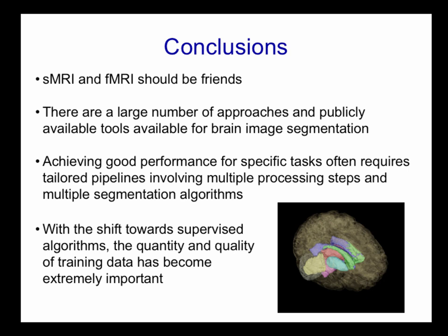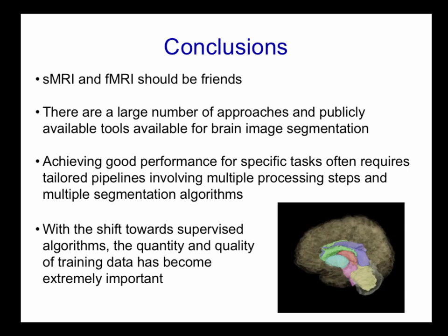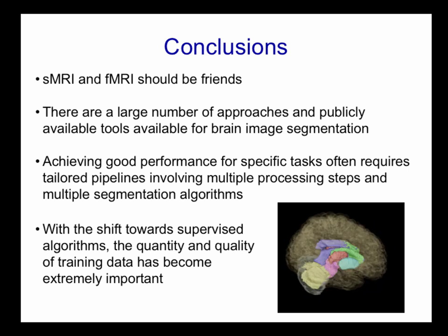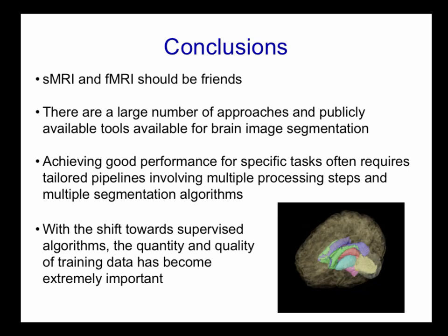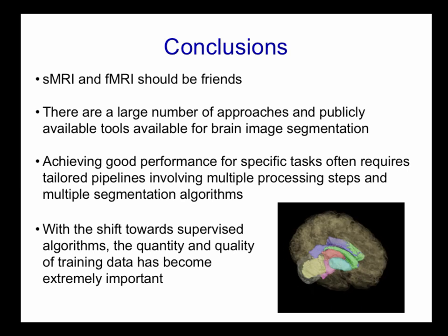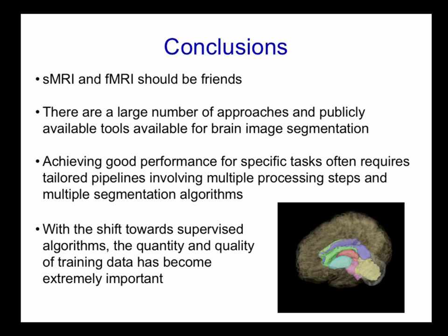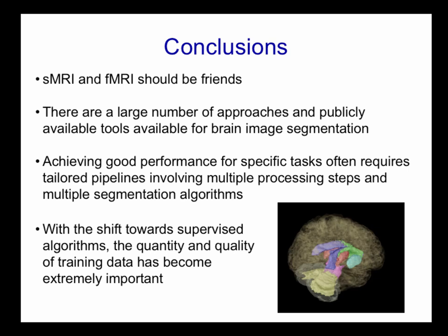DeepNat, I think specifically, is a whole brain segmentation deep learning approach, which probably represents the state of the art in terms of getting whole brain segmentation. In terms of inhomogeneity correction, typically people are applying a pre-processing step to remove that. And that works quite well at 3 Tesla. It doesn't work well at 7 Tesla. It's not really sufficient at 7 Tesla, but for 3 Tesla images, there's an algorithm called N4ITK, which works quite well.